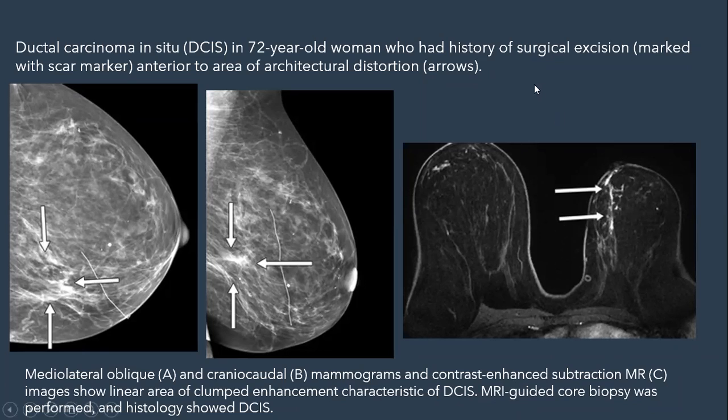The patient had a history of surgical excision marked by the scar marker. You see, this is a scar marker, I think. So this is the area nearby. It's not exactly at the same location, but nearby. I have to go further and evaluate it well.